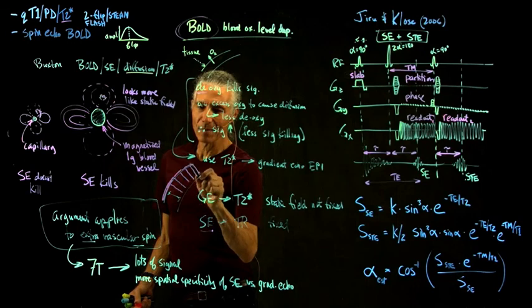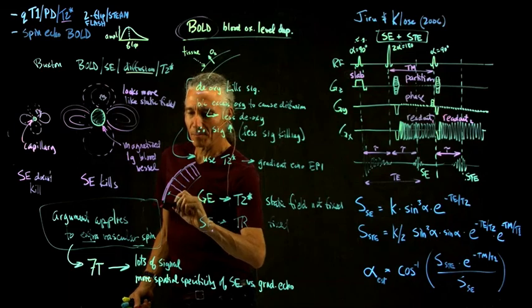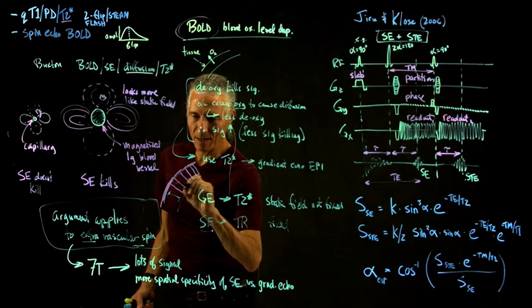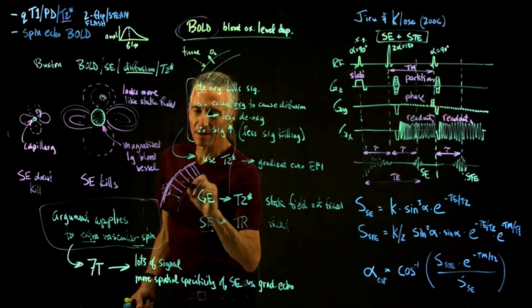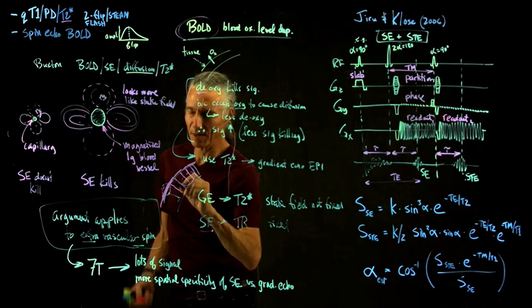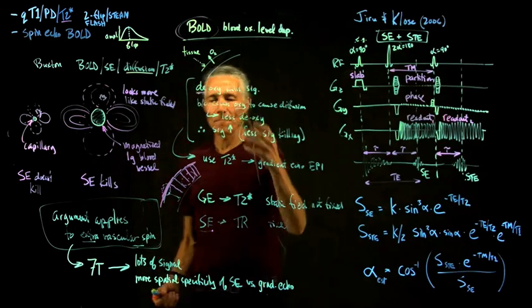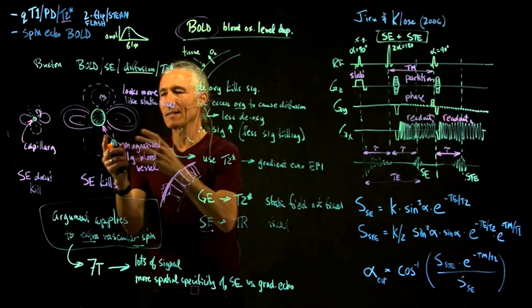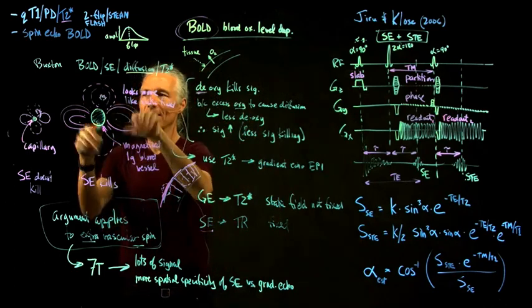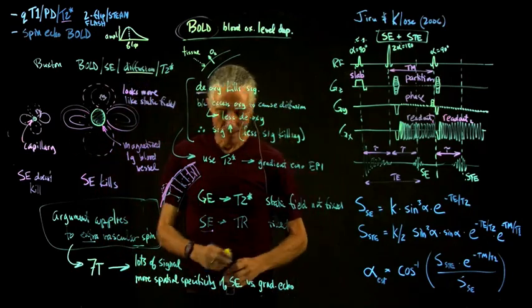Unfortunately, we get a lot of signal from these big ones here, but that's more contaminated signal, because maybe there was some blood rushing here, but it's actually going over here. We picked up a big extra bolus of blood here, where really we want to know that the signal was coming out of this part of the cortex, not just passing by. So that's the interest people have in using spin echo BOLD to detect the BOLD effect, with the hope of canceling out some of the signal coming from the large vessels and focusing on the small capillaries.